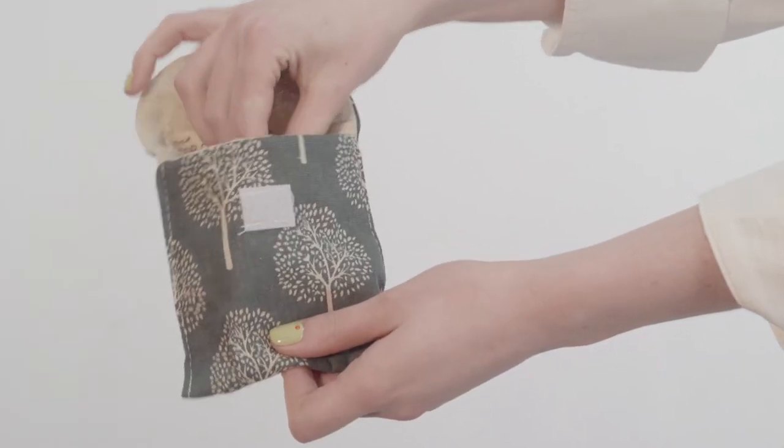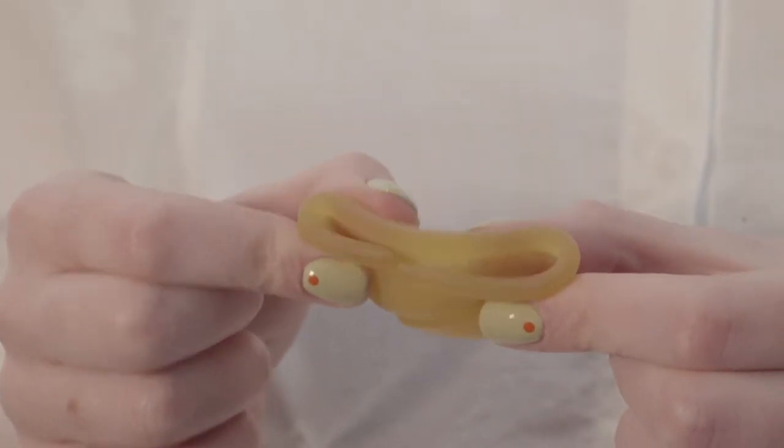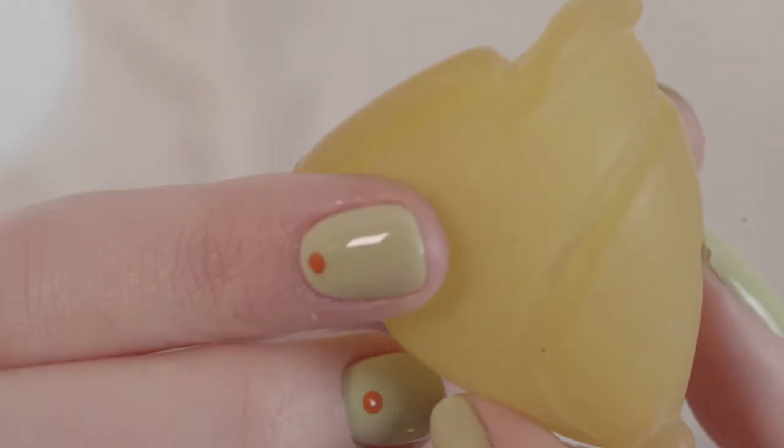Hi, I'm Ruby from Loop Period, part of the Havir family, and today I'm going to teach you how to fold your menstrual cup. Because the Loop Cup is a nice soft menstrual cup made of natural rubber, it's really easy to fold, and there's so many different folds you can use. I'm going to show you my favorite ones.